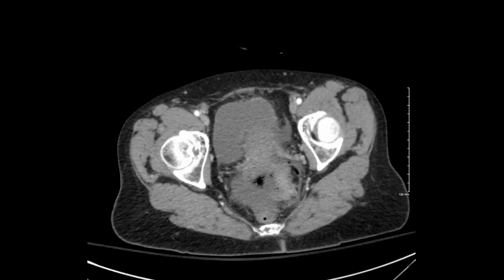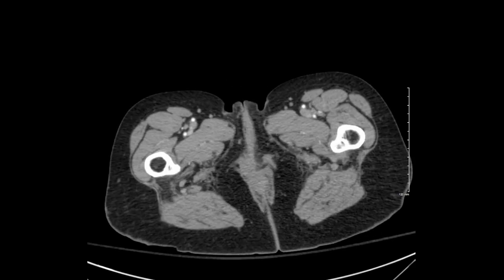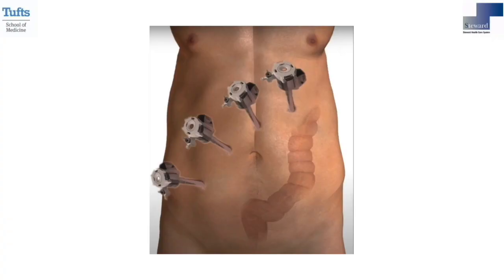We decided to proceed with a robotic approach, placing a total of four ports in a straight line, as demonstrated in this figure.